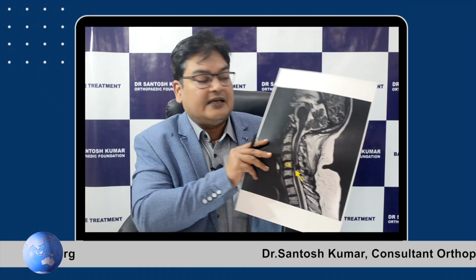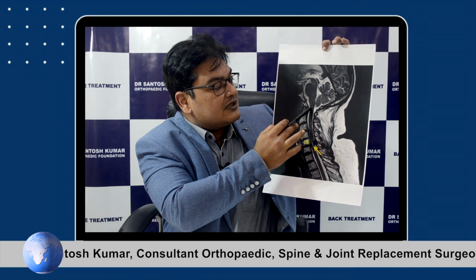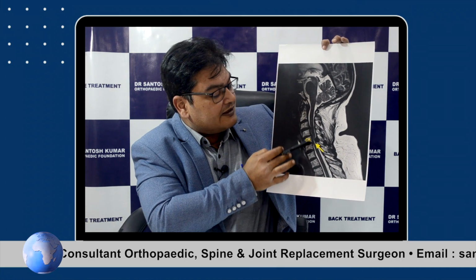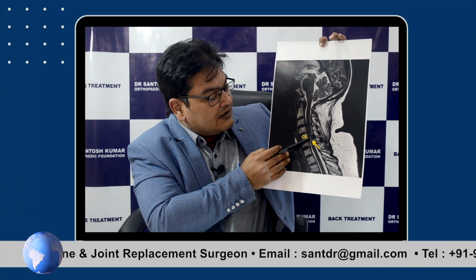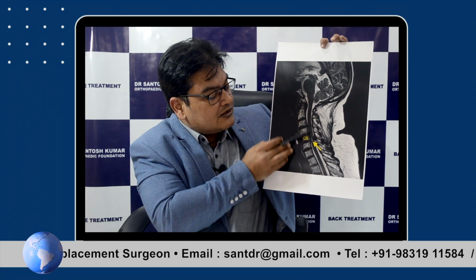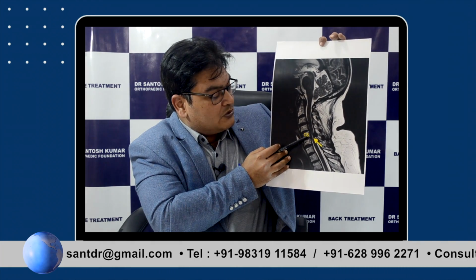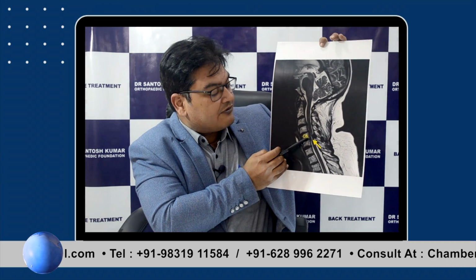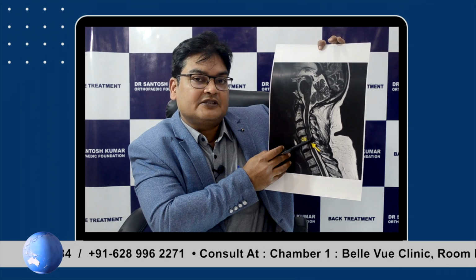This is an MRI, a cervical spine neck MRI. This is the upper brain. The one which is above the spine is the brain, and this is the cervical spine MRI. It has got a big disc prolapse at C5 level. Now this part is the spinal cord, the spinal canal, and this can get compressed from both sides, from front as well as behind. From front the disc compresses it, and from behind it is the ligamentum flavum which gets hypertrophied, which gets thickened, and then it compresses the spinal canal.